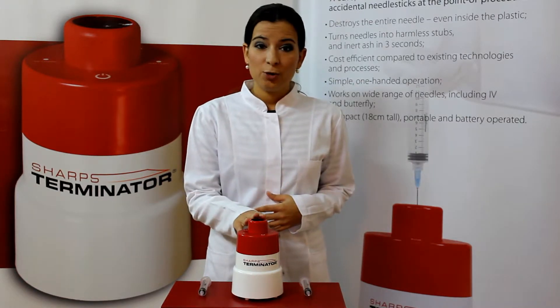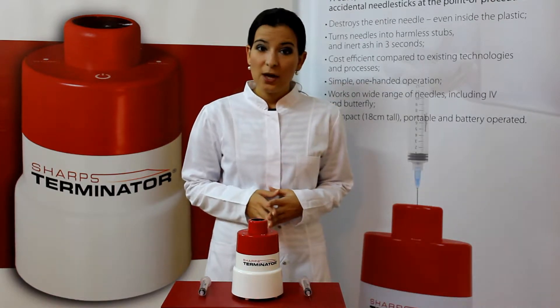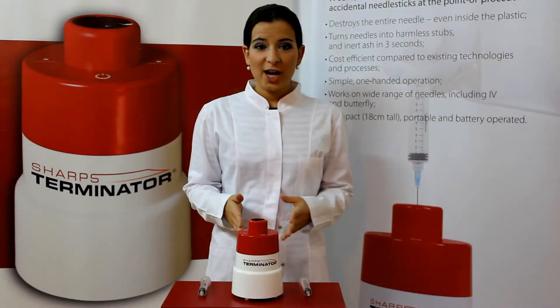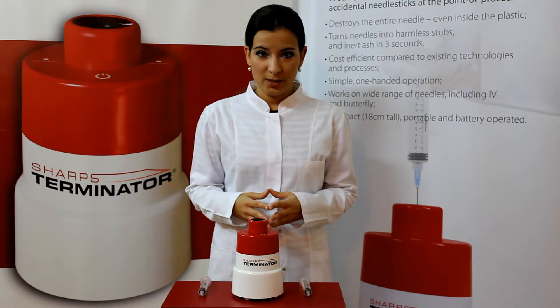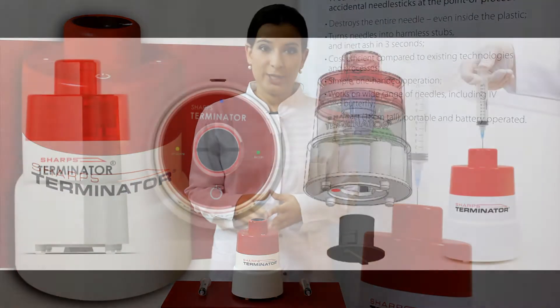It is designed to destroy a wide variety of stainless steel and aluminium needle types from 0.3 to 1.2 mm and up to 10 cm long. The Sharps Terminator can burn from 150 to 200 of the most commonly used needle types, such as 0.8 mm, before recharging.